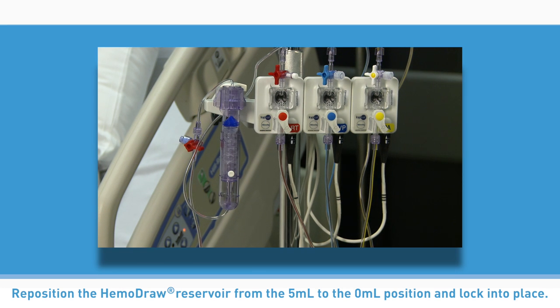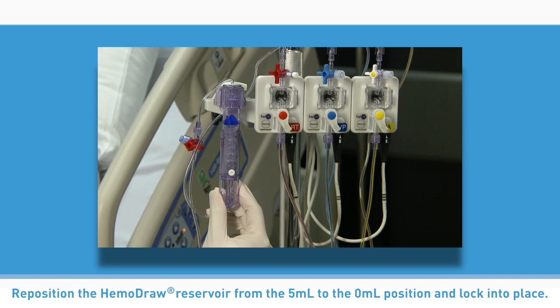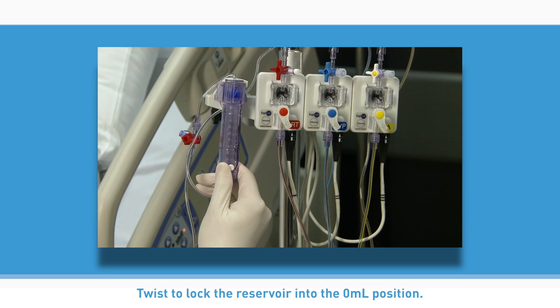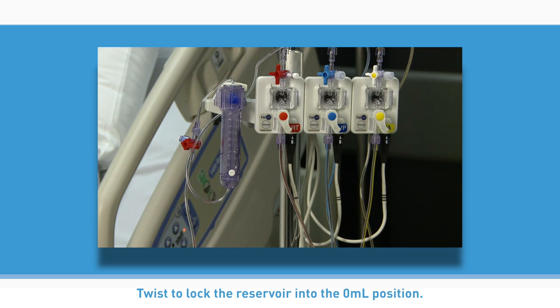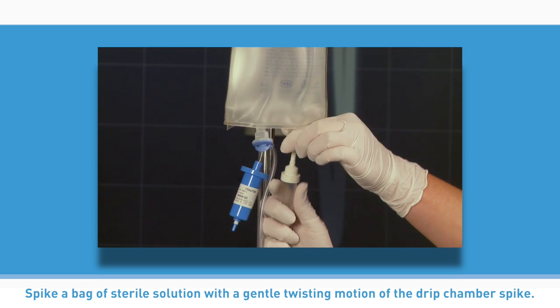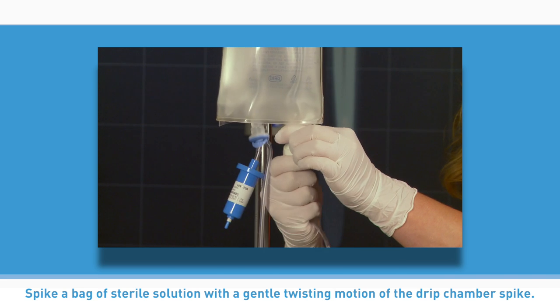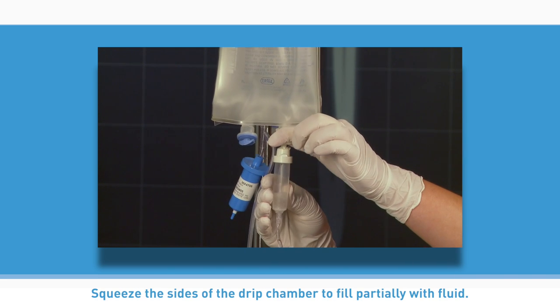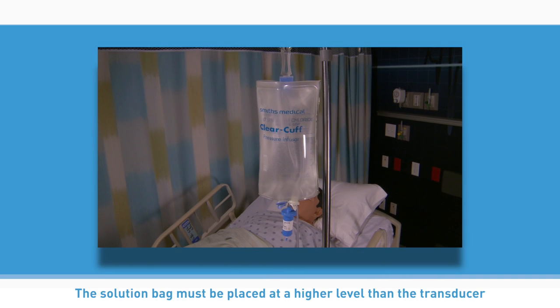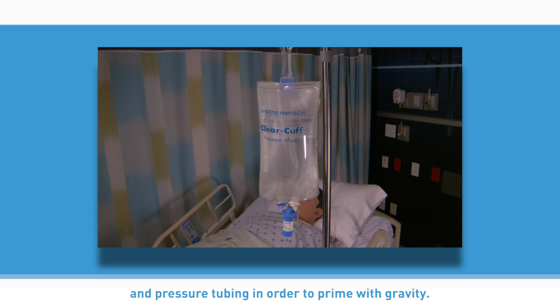Reposition the Hemodraw reservoir from the 5 milliliter to the 0 milliliter position and lock into place. Twist to lock the reservoir into the 0 milliliter position. Spike a bag of sterile solution with a gentle twisting motion of the drip chamber spike. Squeeze the sides of the drip chamber to fill partially with fluid. The solution bag must be placed at a higher level than the transducer and pressure tubing in order to prime with gravity.